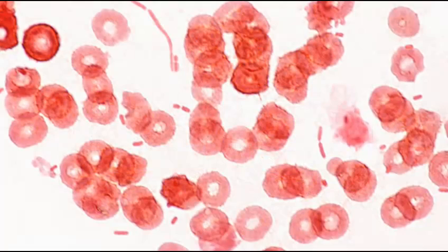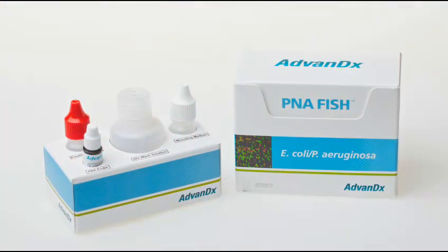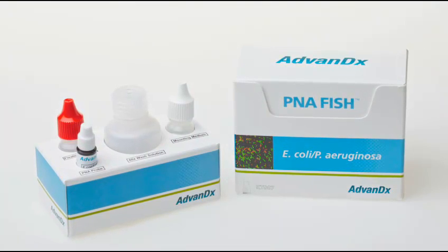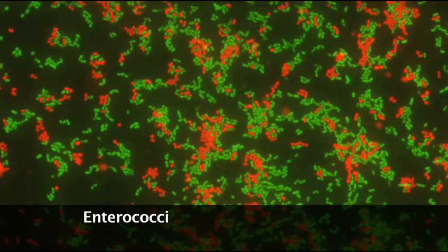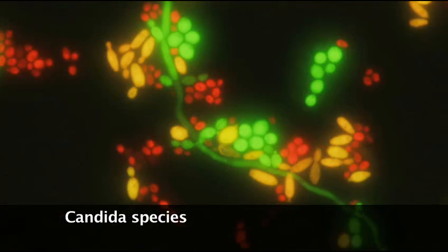Or, if the gram stain reveals gram-negative rods, the E. coli / P. aeruginosa PNA FISH test will be performed. AdvanDx offers kits that cover all major categories of bloodstream pathogens, including staphylococci, enterococci, gram-negative rods, and candida species.